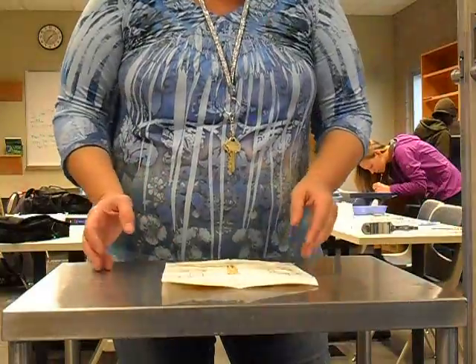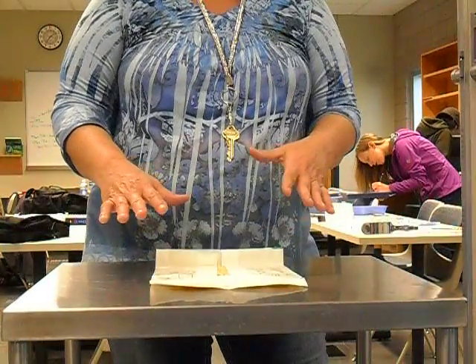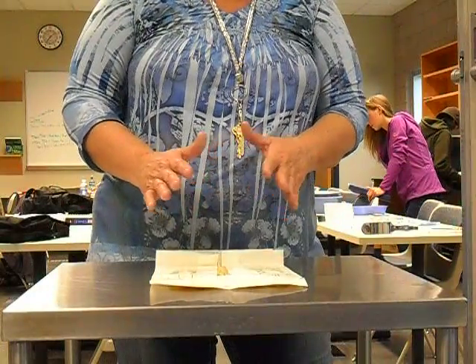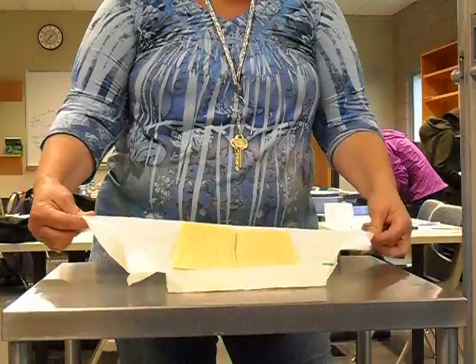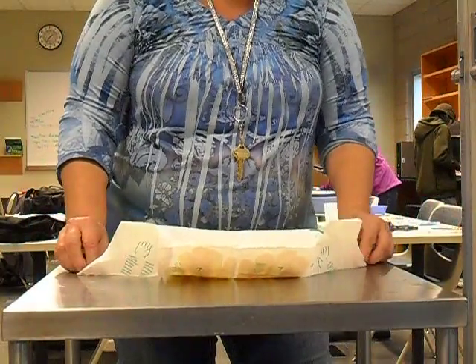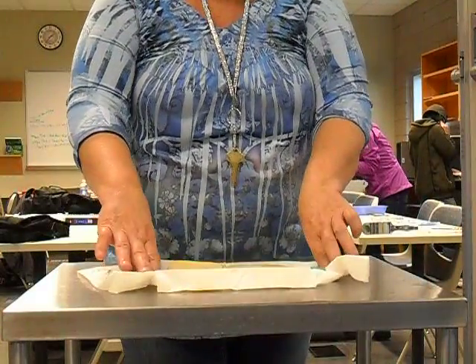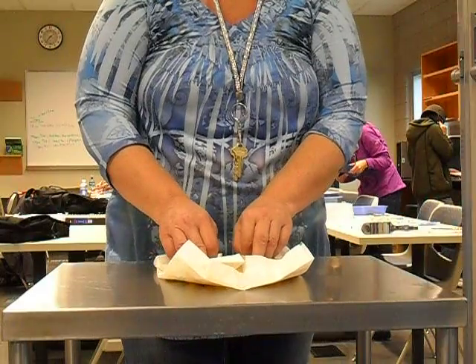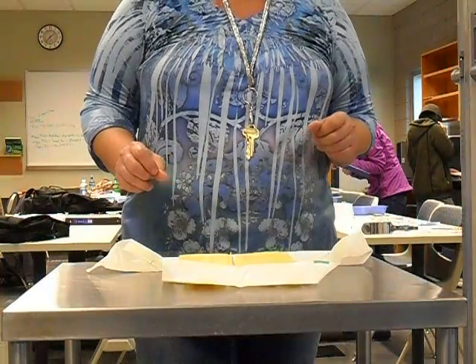The gloves are in an inner package, and what we'll do then is lay the gloves down, and I like to fold the bottom back and grasp only the bottom edge. Because this is packaged in paper, it has quite a bit of memory, and it has a tendency to fold back on you, and you could potentially contaminate. So I like to open up the package, and then what I do is just pinch the corner a little and fold it back. And the package will usually stay open. Now, if you were to do something like this, you haven't contaminated the gloves. However, if the package folds back, now your gloves will be contaminated. So that is why I only touch the bottom corner. I fold it, and it should stay open for you.